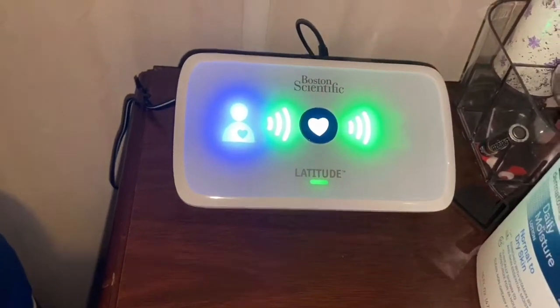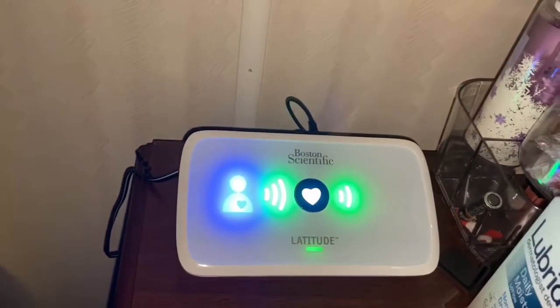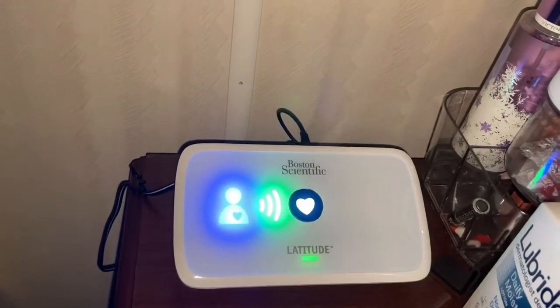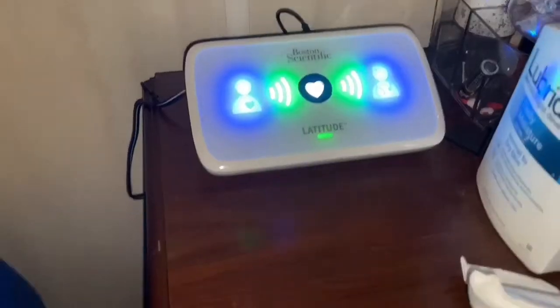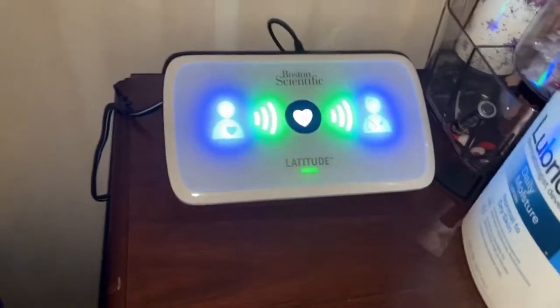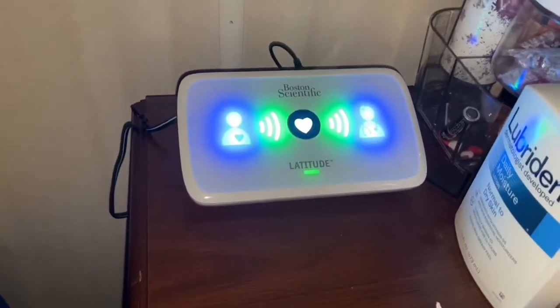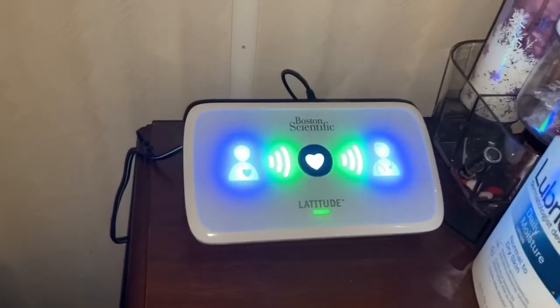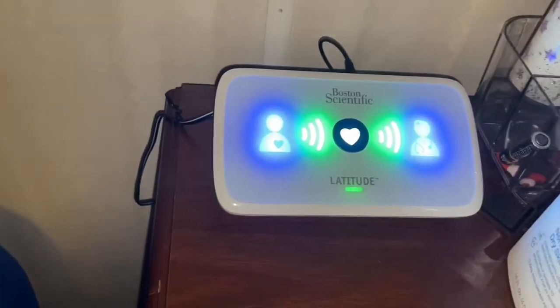Okay, so there you go. And it's already complete. The setup is already complete and it will turn off automatically after 2 minutes. So it will turn off by itself after 2 minutes.